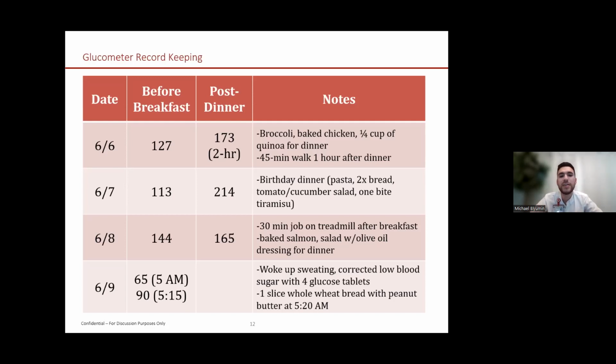The next day, it looks like the readings are again back to where they were, and it's mentioned that the person did 30 minutes on the treadmill. They had a baked salmon for dinner. So it explains getting back to what the regular routine is.